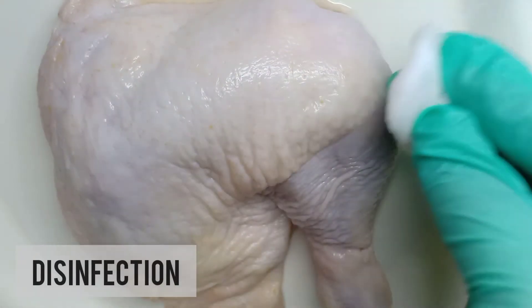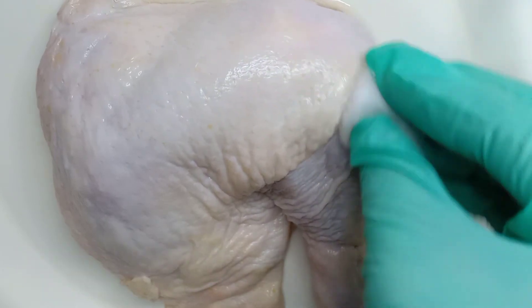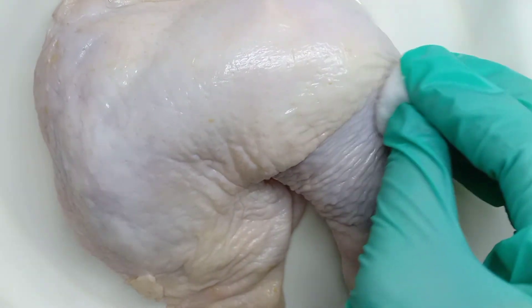With a cotton soaked with alcohol, clean the injection site and allow it to dry.